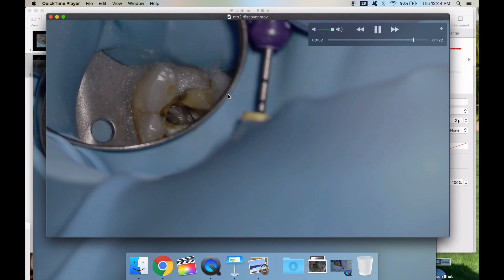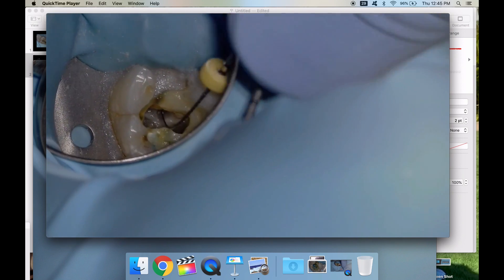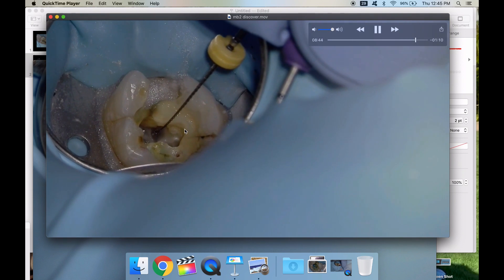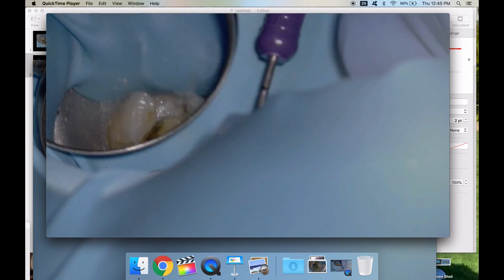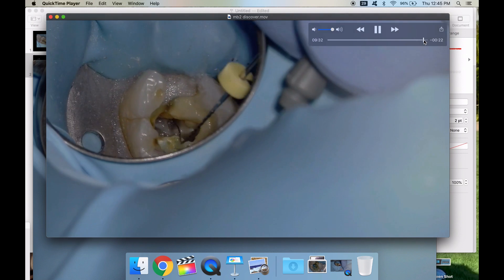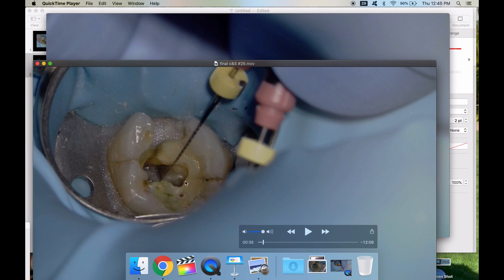I'm not going very far into the canal — it's very short. I'm trying to open up space to my cutting flutes, just a little bit, not trying to jam it. I'll watch it wind, pull it out, then rinse again. Same thing — six, eight, ten, six, eight, ten — slowly making my way all the way down the canal. You can see we're getting a little bit further down with each pass.